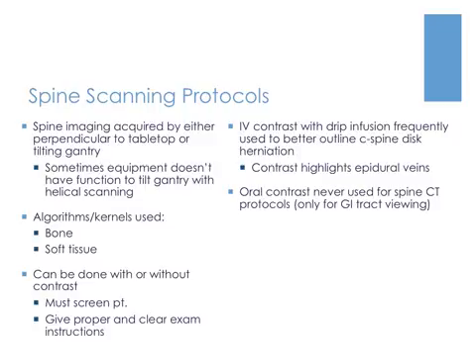And when you are imaging a patient, you need to be sure to screen the patient with the contrast questionnaire that your facility may have, and you need to give proper and clear exam instructions.